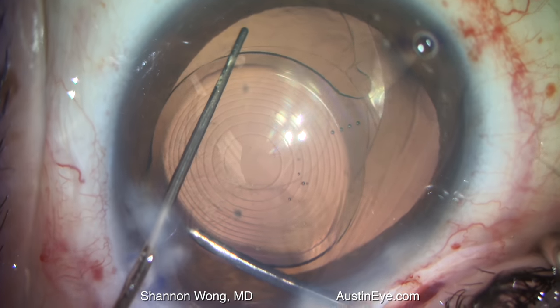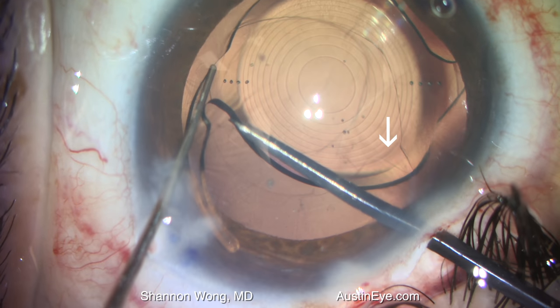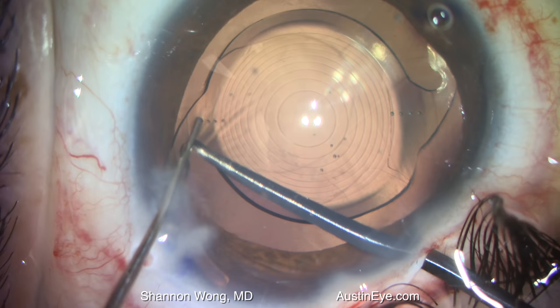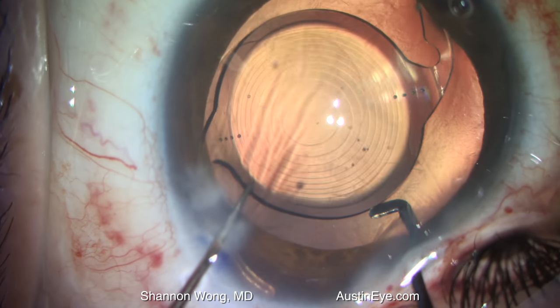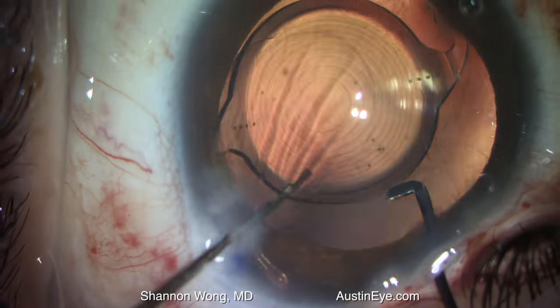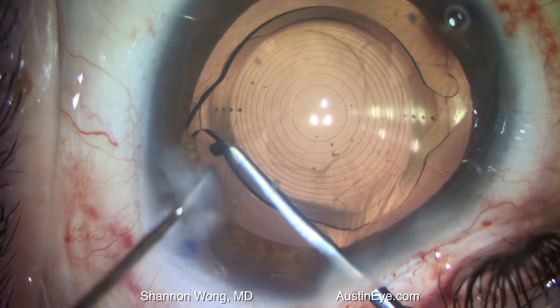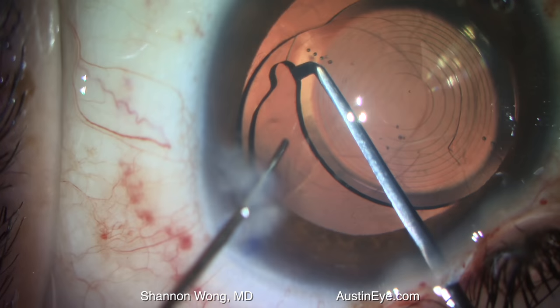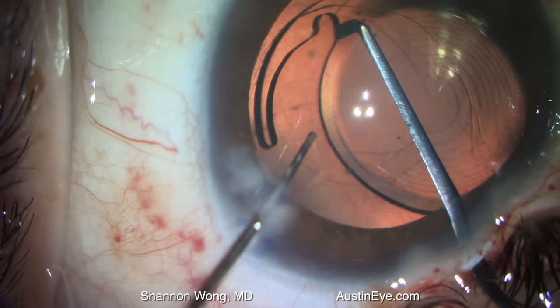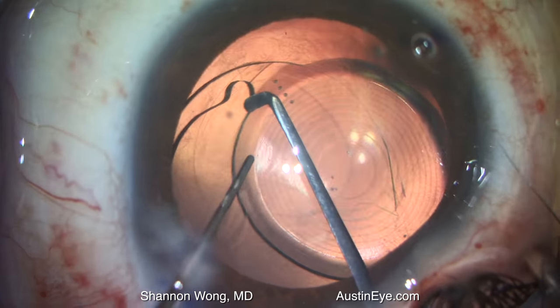We use an epsilon titanium chopper and a cyclo-dialysis spatula to rotate the lens into the capsular bag. The optic is within the capsular leaflets, and then finally, we rotate the trailing haptic into the capsular bag.